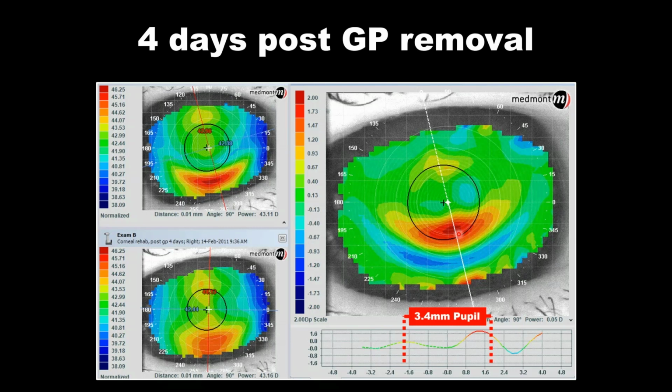We know the eye is changing, and therefore cross-linking may be called for. If we see a complete area of green showing you basically zero change between visits, it appears that cornea isn't altering in the least. And therefore, it may not be likely that we need any form of cross-linking. It could be just a droopy cornea.